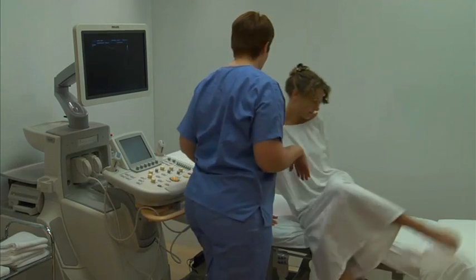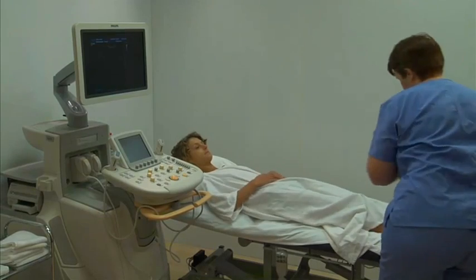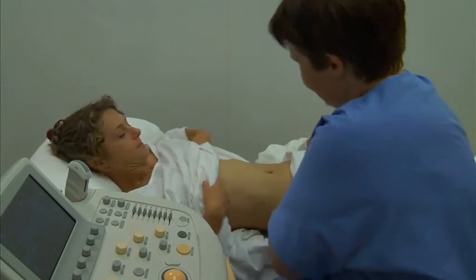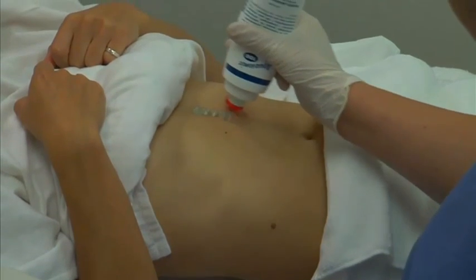Ask the patient to lie supine on the bed and make them comfortable with the use of pillows or wedges positioned as required. Expose the abdomen and apply pre-warmed acoustic gel from the xiphoid sternum to the umbilicus in the midline.